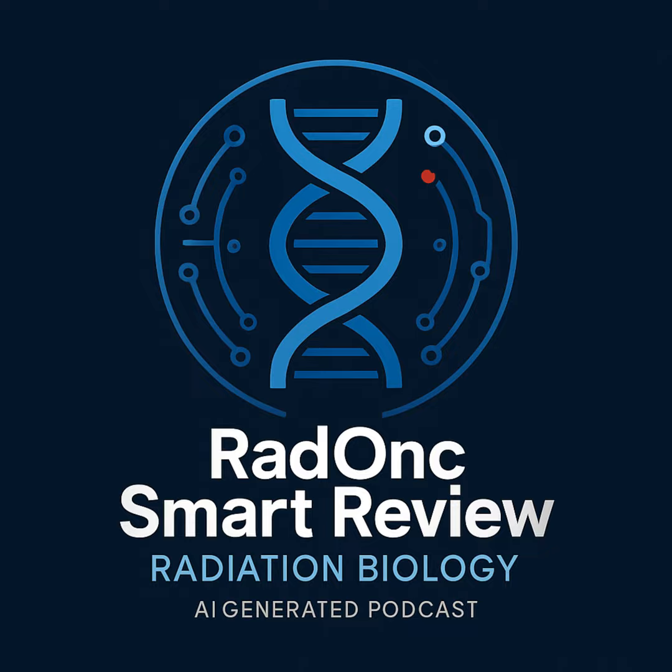So better target definition. And you mentioned response assessment too. Yeah, tracking that SUV change on FDG PET during or after treatment gives us a really powerful early look at whether the therapy is working biologically. And looking forward, those hypoxia PET scans, that potential for dose painting seems huge. It really does.